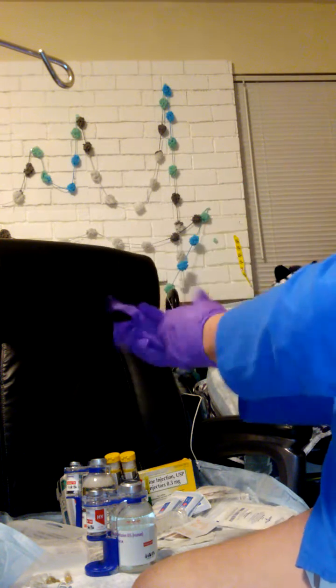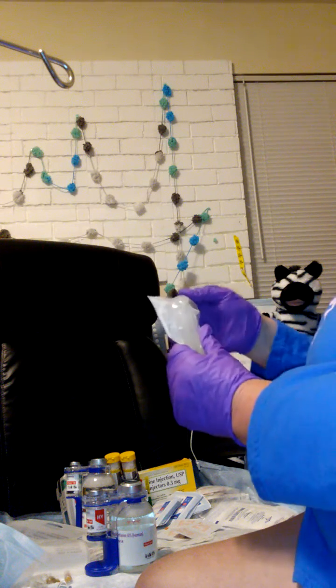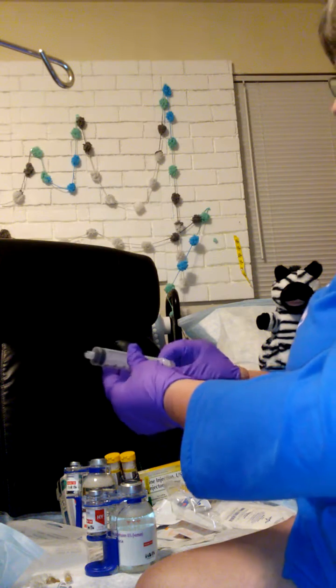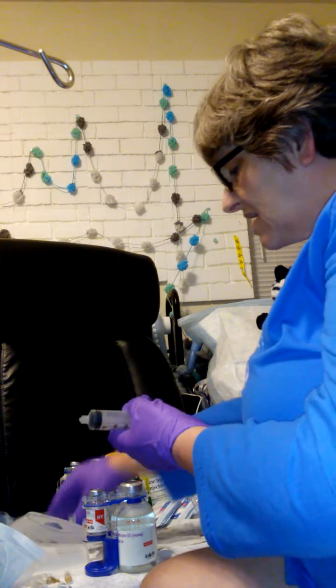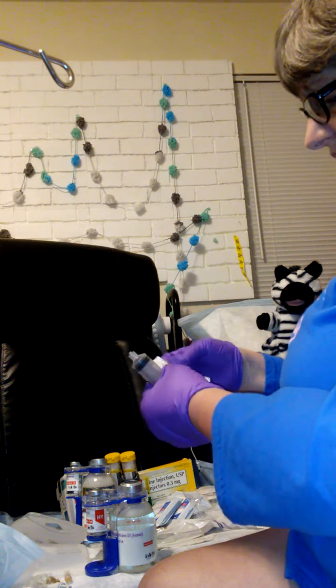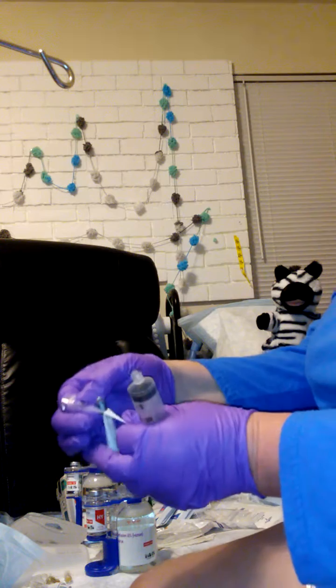I'm going to get my gloves on here. Probably can't see a whole lot because I don't have a very professional system, but for anyone who may be curious of how I do my infusions at home, this is it. So I'm getting ready to put a blunt needle on here so that we can go ahead and get started. Okay, here is the blunt needle.